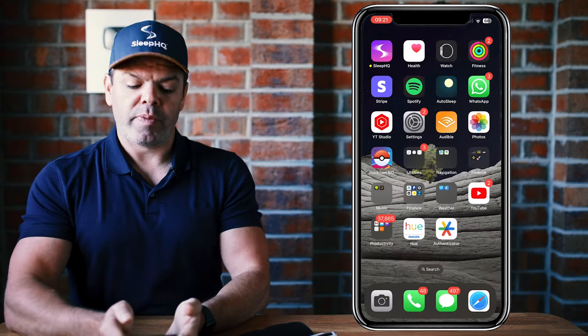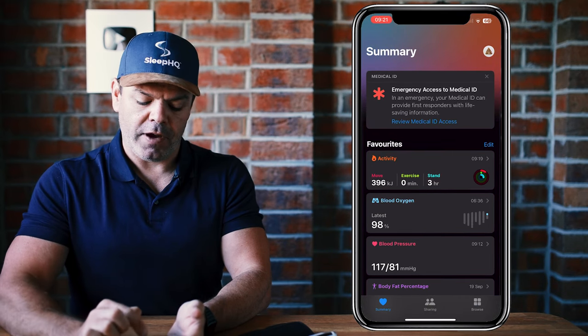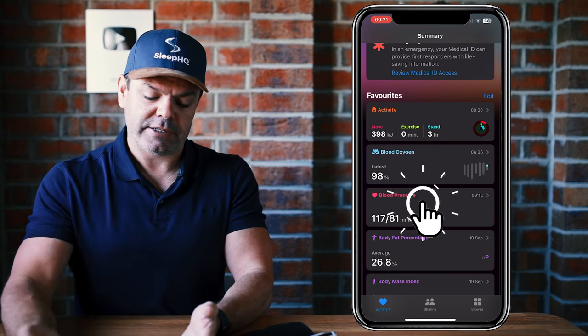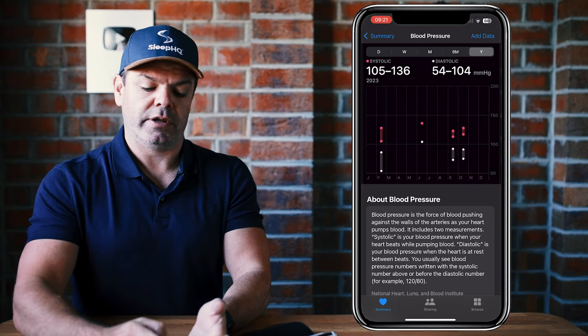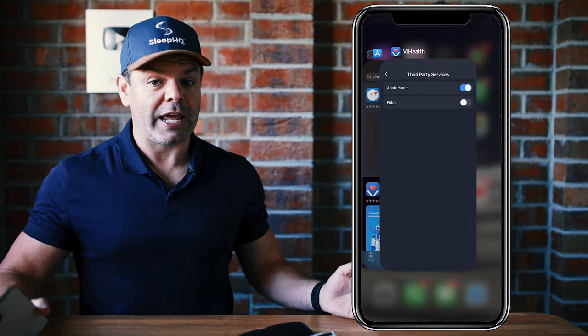When we open up Apple Health in the summary tab, we can see the blood pressure reading right there — 117 over 81, which is the measurement we just took. If you click on it, you can also look at different ranges: month, six month, over a year and so on. I don't really need to track my blood pressure because it's pretty damn good.